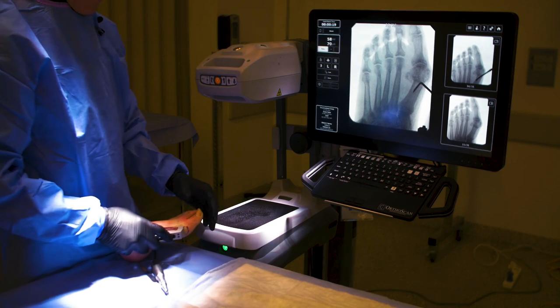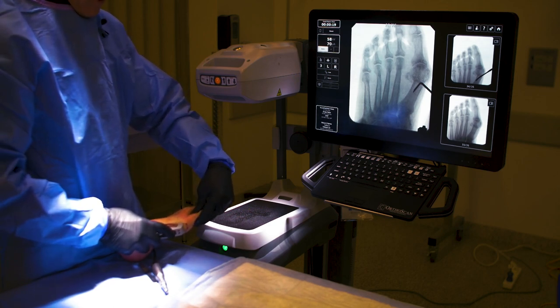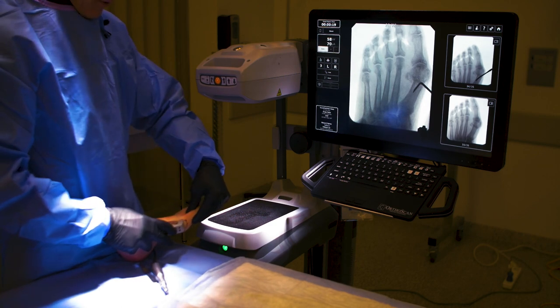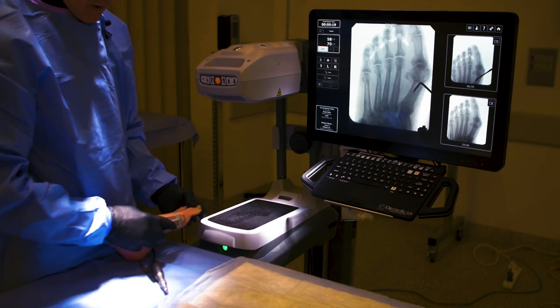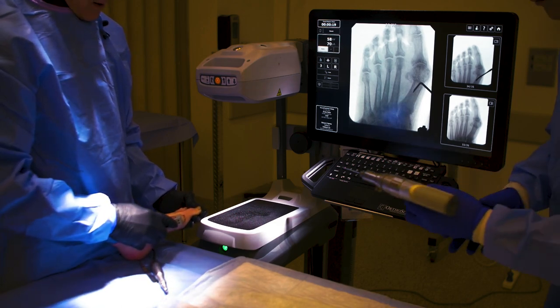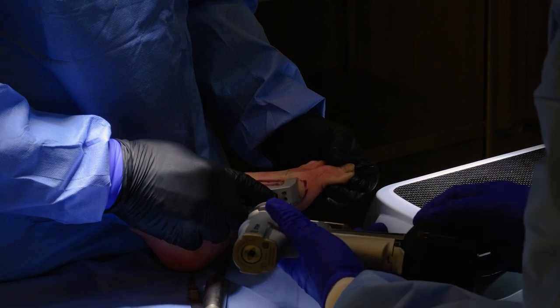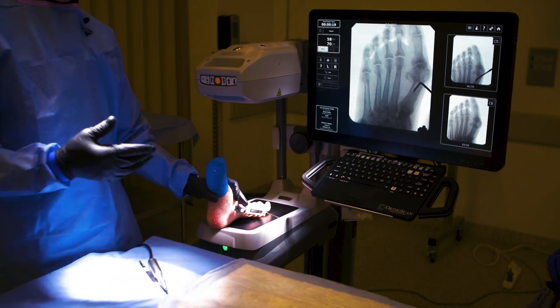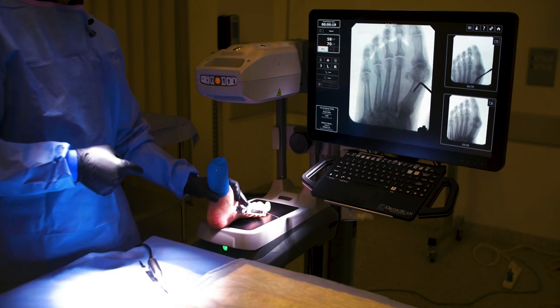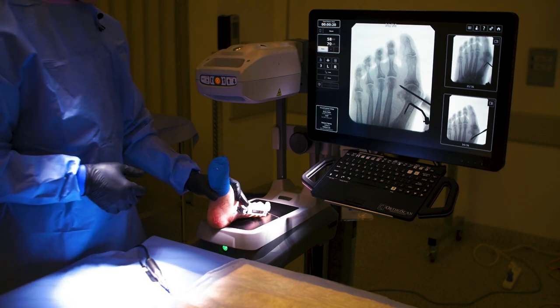This specimen is somewhat arthritic so the joint can be a little stiffer, but I want to be able to derotate and prevent any varus. As I do that, I'm now putting the head where I want it and I can pin it to the guide. You have two options — an upper and a lower hole. Pin it in the upper hole, grip it tight, and you should be through both cortices. When I first did this on an older woman, above 65 we worry about osteopenia, but this was so much more reproducible than putting in our manual translators. Now you're pinned into place.